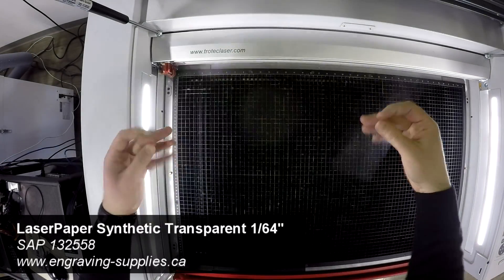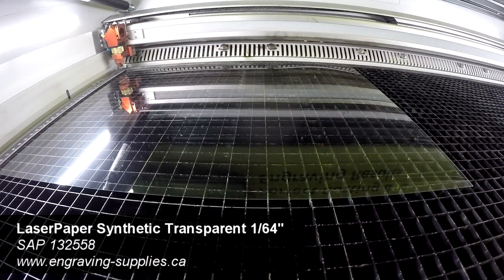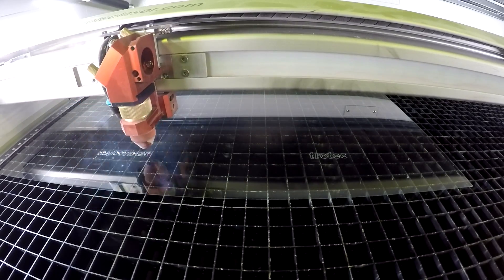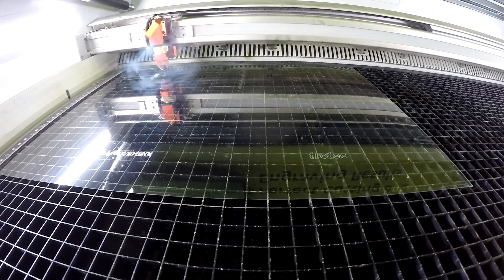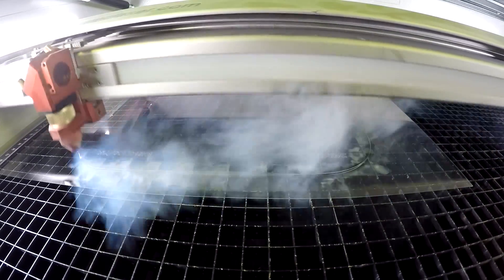We then place our 1/64th of an inch Trotec synthetic clear paper into the laser and proceed to cut the face shields. You can use any kind of clear PET grade plastics for this. We've kiss-cut our logo and link to the COVID-19 kit, but users can place names, serial numbers, and so on.